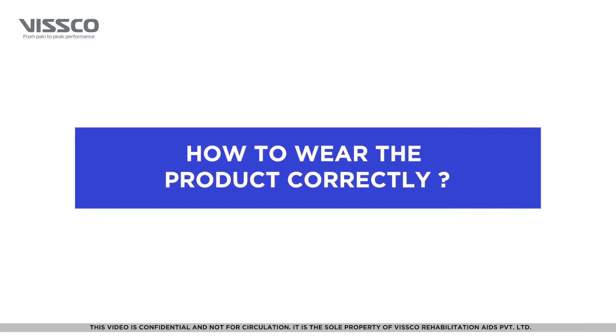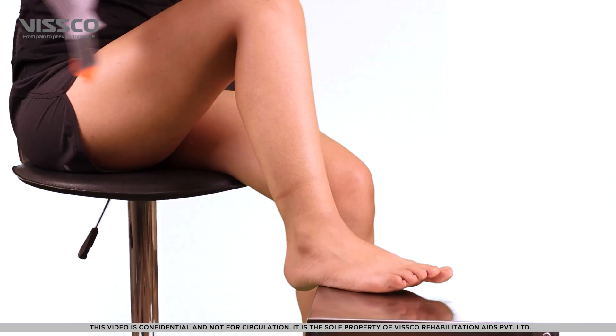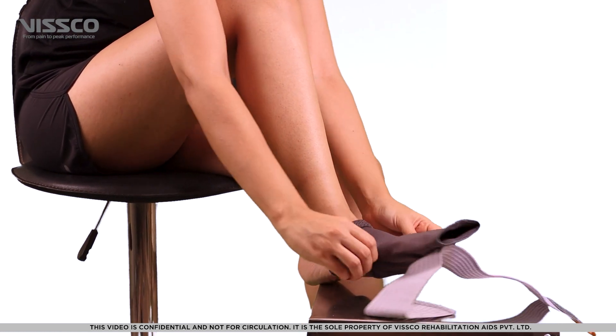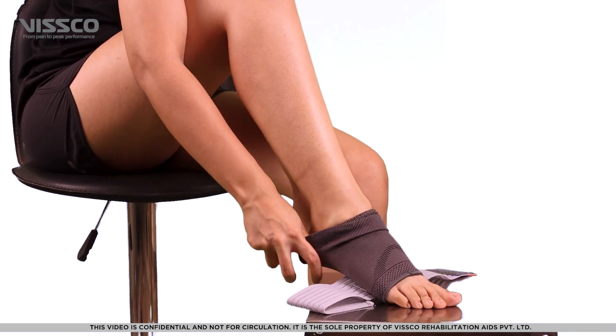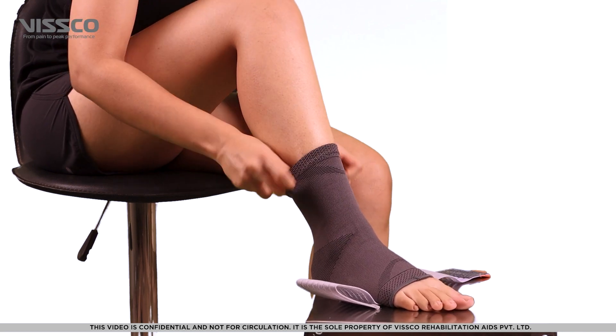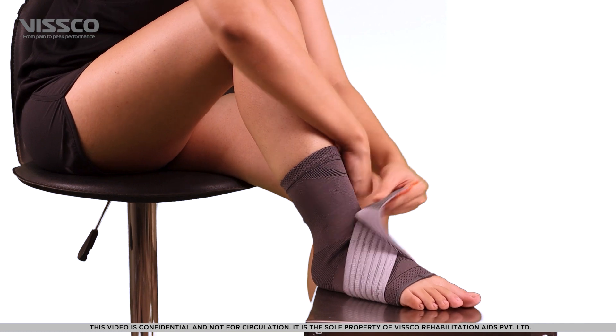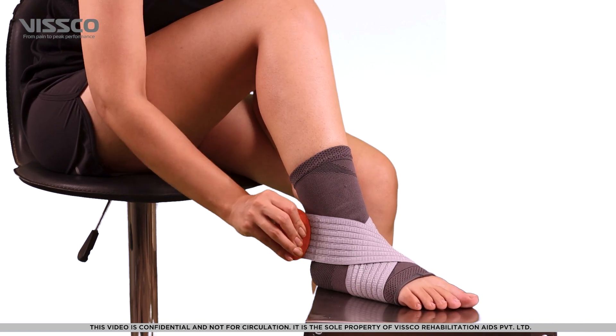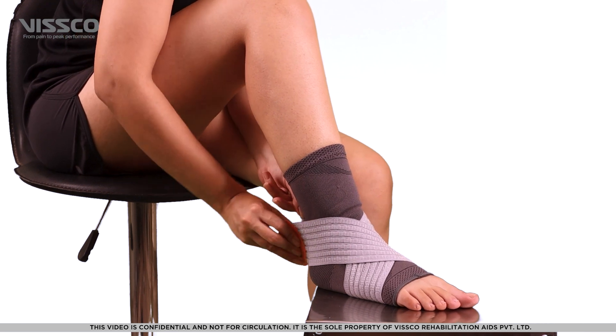Now that you have selected the right size, let's wear the product. First, pull over the support like wearing a sock, so that the soft portion comes over the heel. Now pull both the straps in a criss-cross pattern and lock to a comfortable and snug fit.